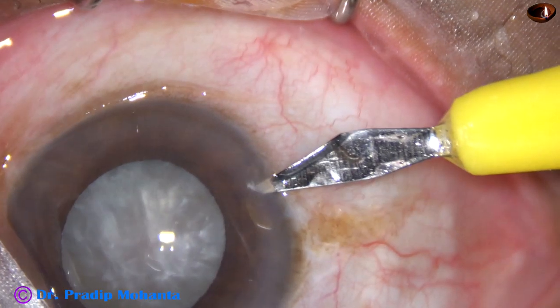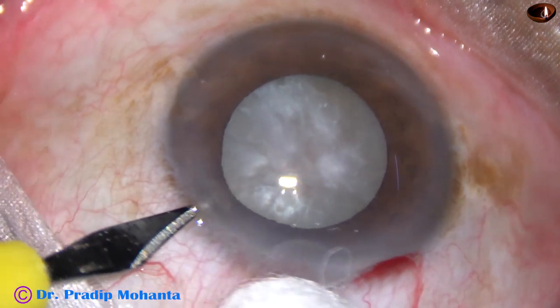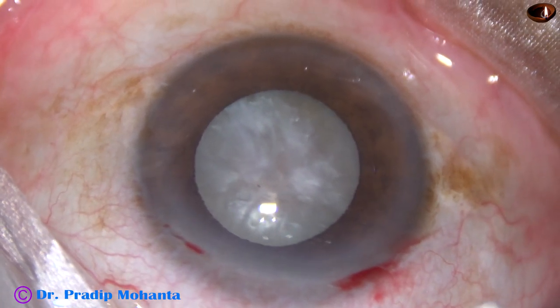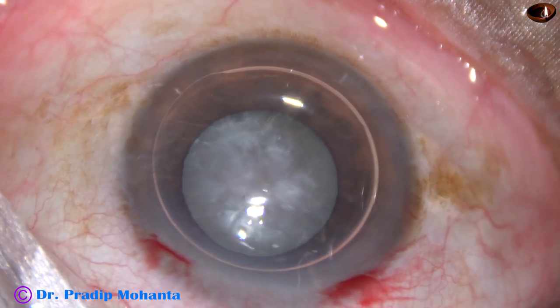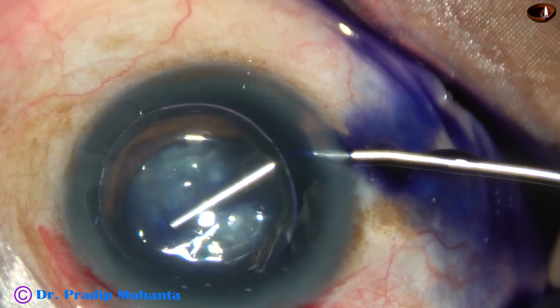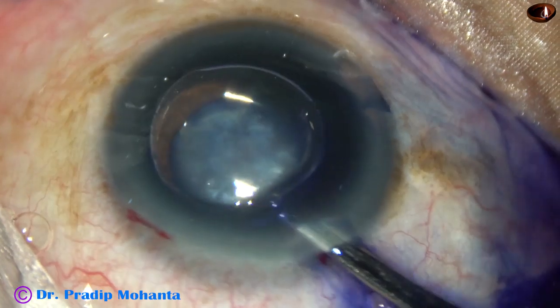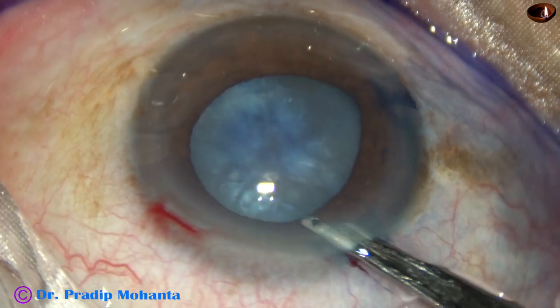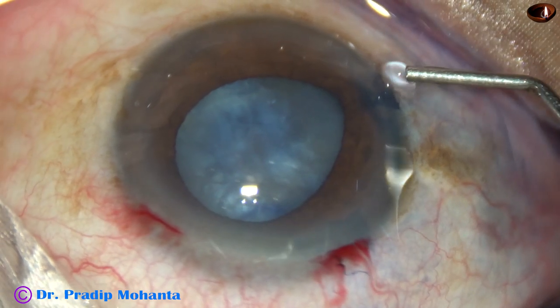The main incision has been made. This is a side port on the right side of the main incision at around 8 o'clock, and this is another side port on the left side at around 1:30 o'clock. An air bubble is injected into the anterior chamber, and then trypan blue 0.06% dye is applied over the anterior capsule. You can see there is fibrous tissue just underneath and involving the anterior capsule. As the dye is washed out, the fibrous tissue just beneath the anterior capsule is clearly visible.